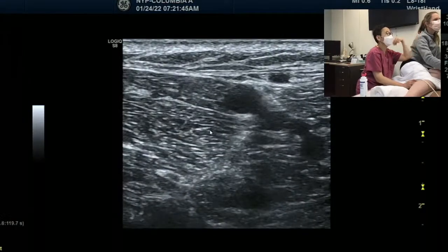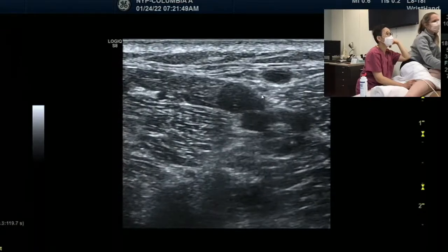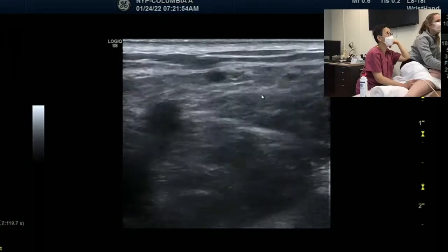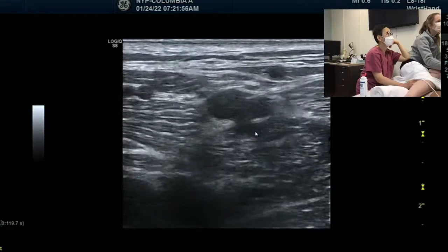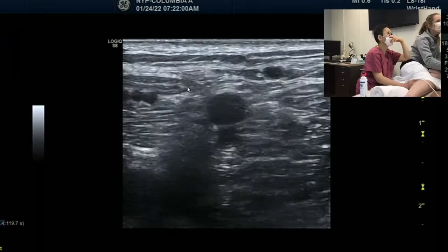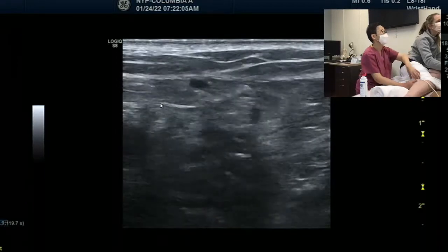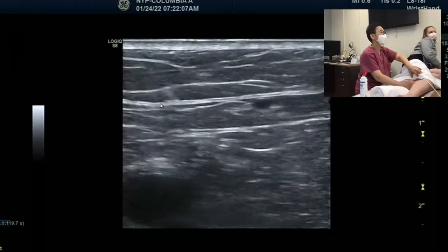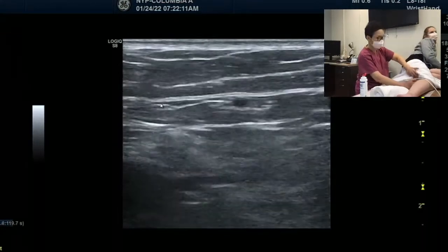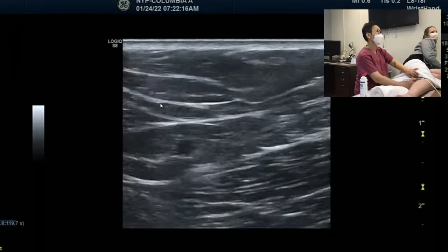Still the tibial nerve. Where's the tibial nerve? The white one. Yeah, that's the tibial nerve. But they're branching out, going inside of the tibial nerve. See, as I go up, look at the gastroc branches. I'm moving up, see it's going there, so it's disappearing. So it all becomes the tibial nerve. I'm going to her calf area, above the, how do we say? Oh, the distal part, going into the sciatic nerve.